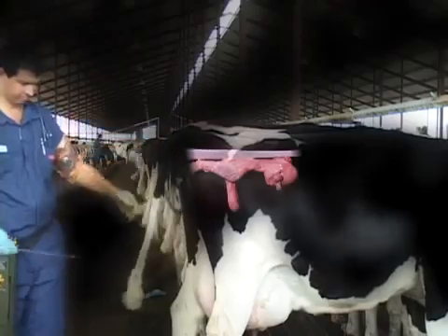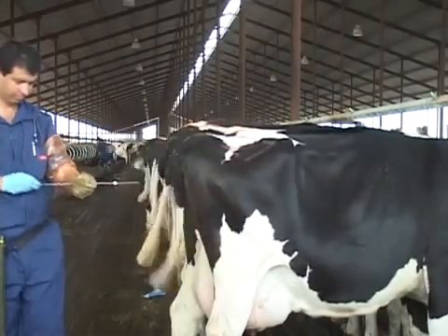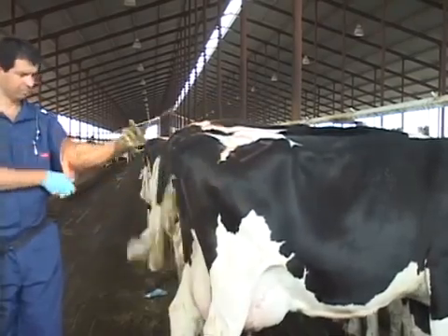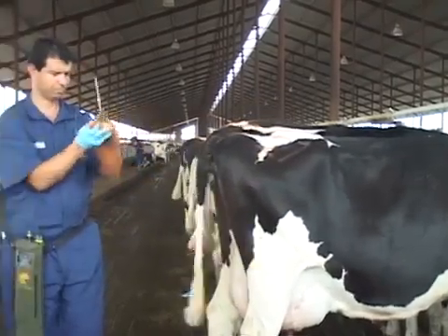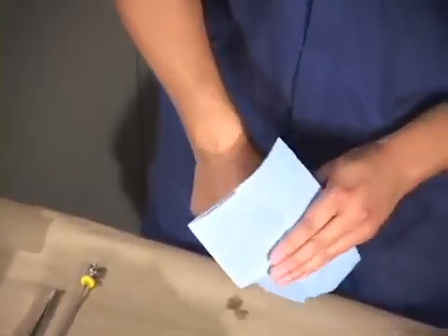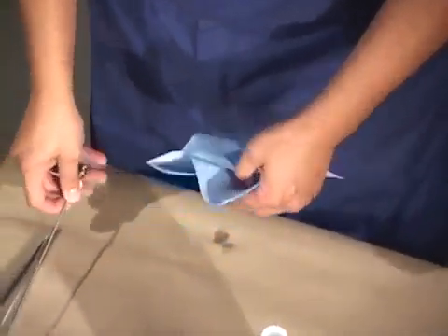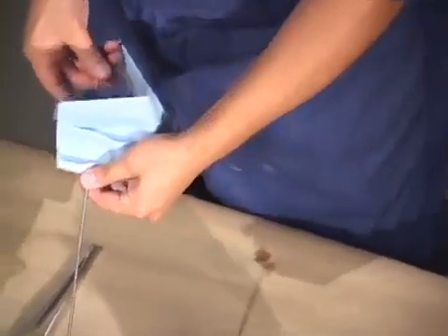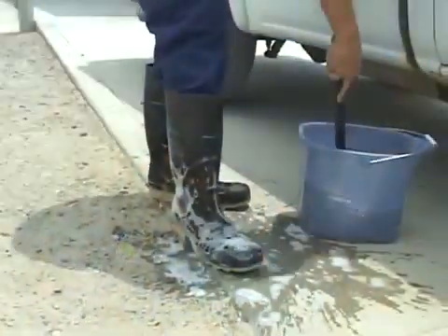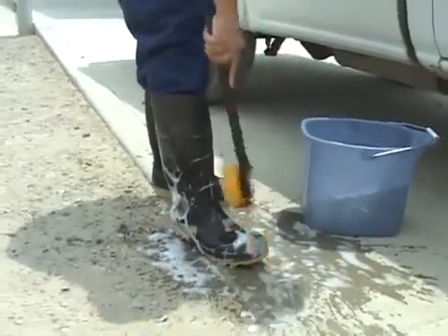After all the semen is deposited, withdraw the AI gun and your arm. Release the sheath and the straw from the AI gun, then peel your glove hand over them and dispose of the package in a proper trash container. Clean your hands after each insemination. Clean your equipment with a paper towel wet with alcohol.